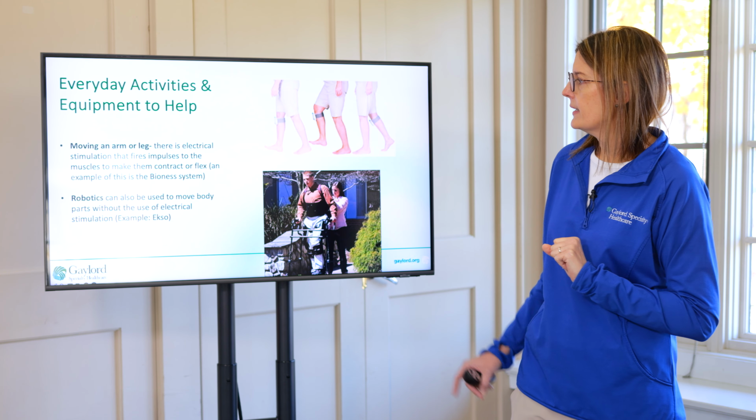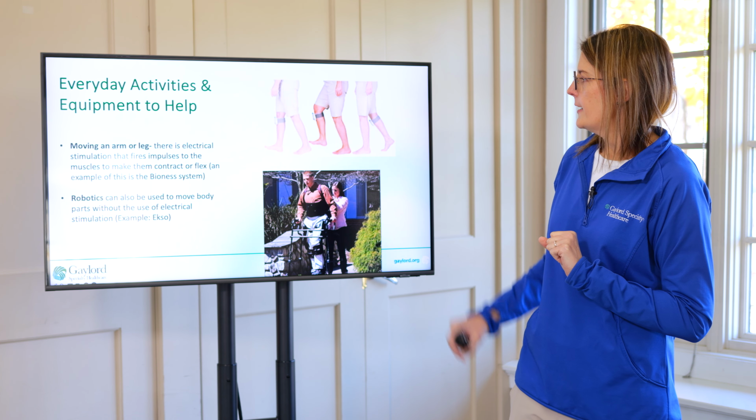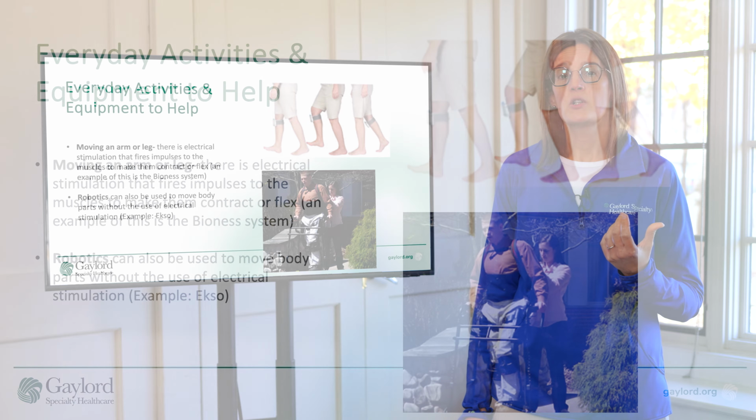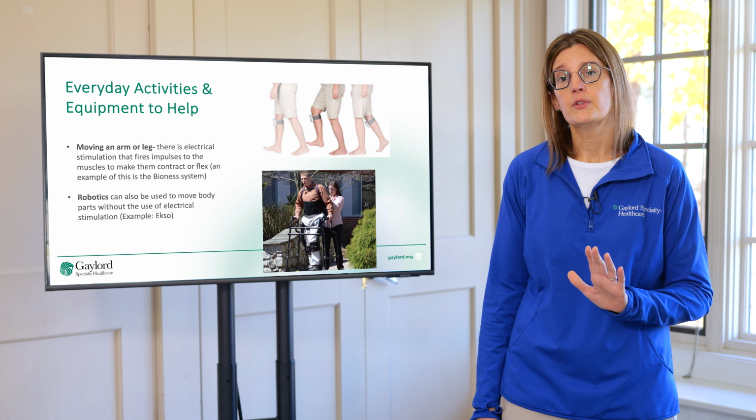This picture that we're looking at here with the individual that has the feet in there, you might see it in there, something around the calf. That's actually the L300 Go. This is a piece of equipment that essentially has a stim pad applied to the calf. The purpose of that stim pad is to stimulate the nerve, which then triggers the muscle to perform the action of being able to lift the foot.